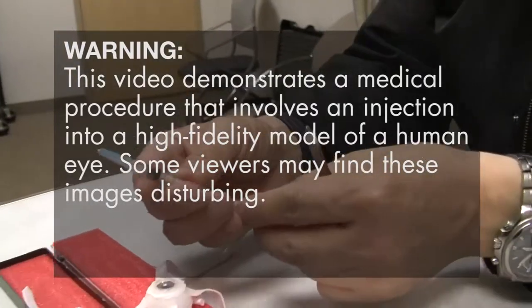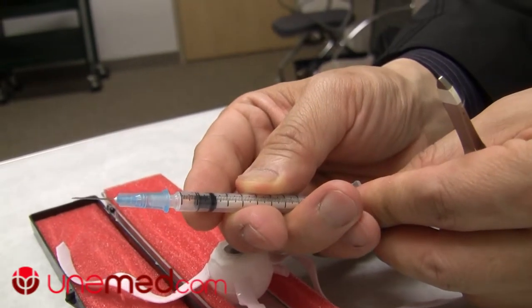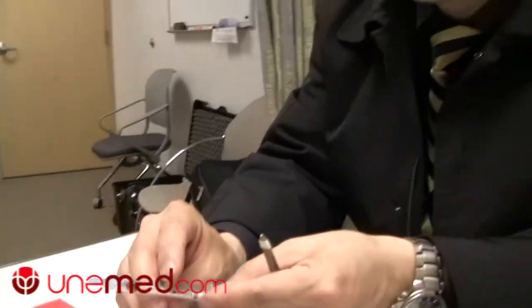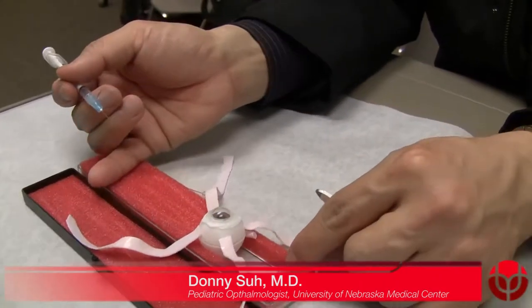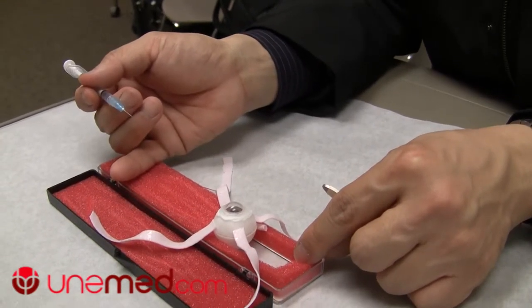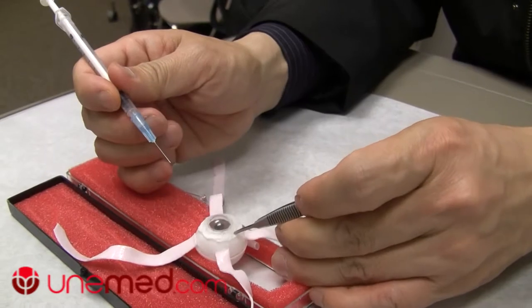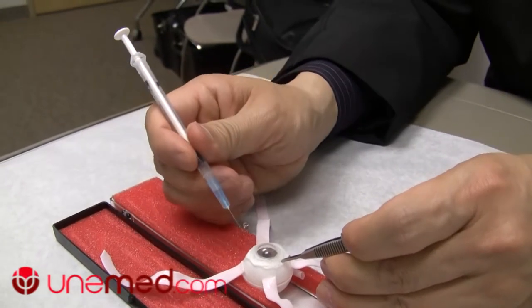When injecting this medication, we're typically injecting from here to here — we're talking about 0.01 to 0.02 CC, so it's an extremely small amount. This is a child who could be moving constantly; they're usually not very happy, as you can imagine. So we would actually have to use a forcep to hold on to the eyeball firmly, and we also have to stabilize the head because the child is moving.